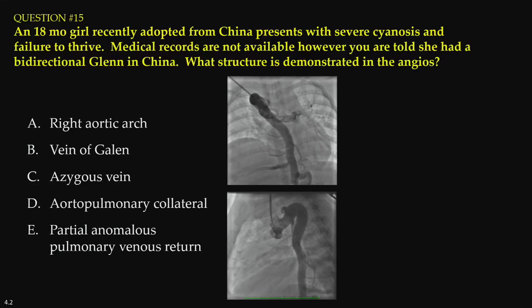So you have your catheter coming in from above, like in a typical patient with a Glenn. That makes sense. It's probably going into the SVC, and you've injected in the SVC, and you see this structure coming off the SVC. And she's blue. And the answer is C, exactly. So this is an azygous vein. I showed this because you also get this question in catheter courses.